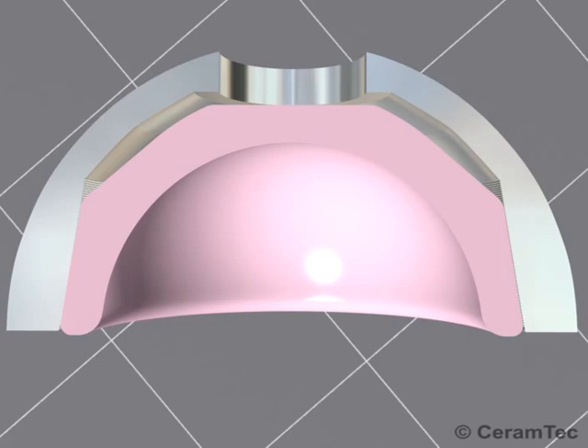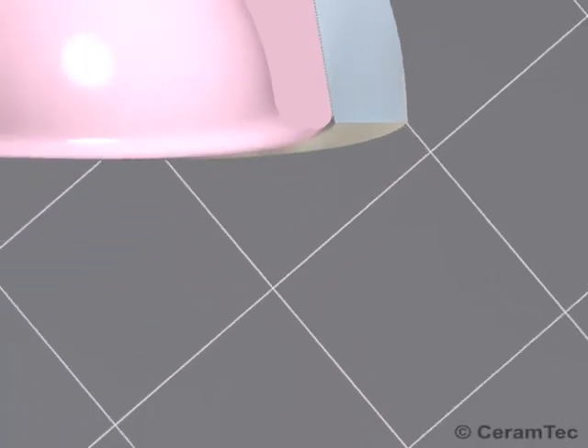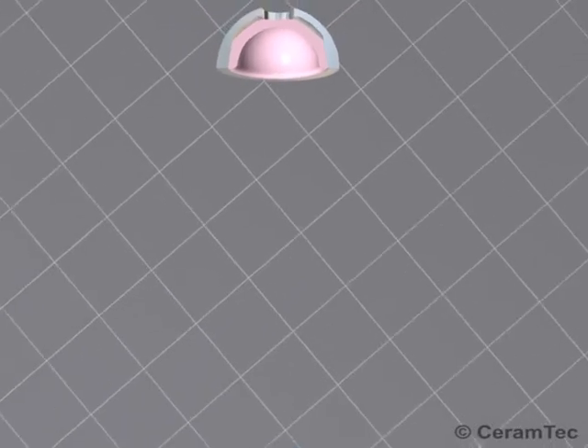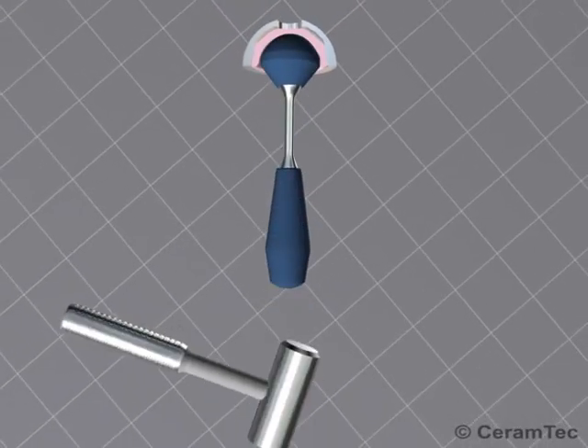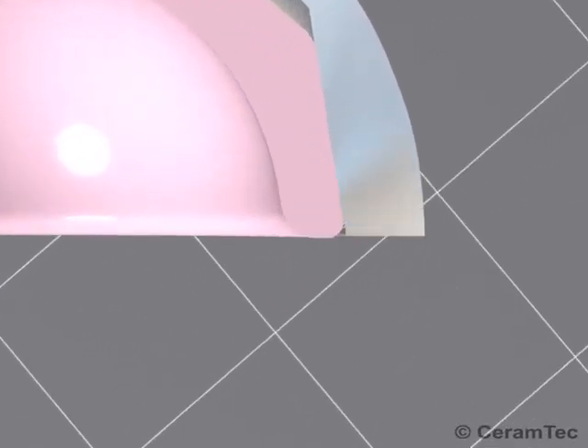After insertion, the metal surface is not yet deformed. Deformation and locking of the insert in the shell occurs when the impactor is tapped moderately with the mallet.